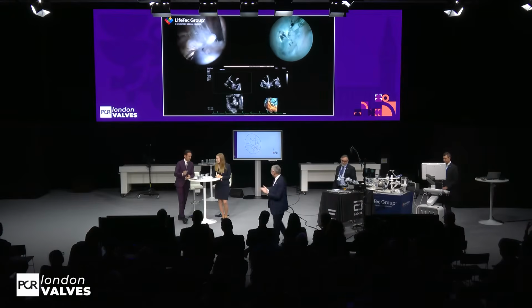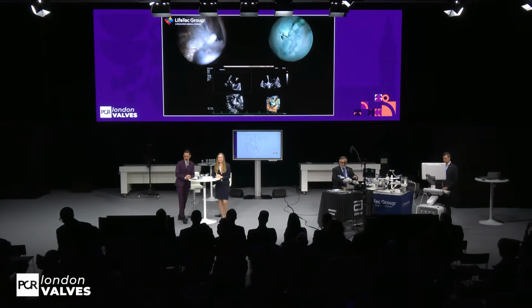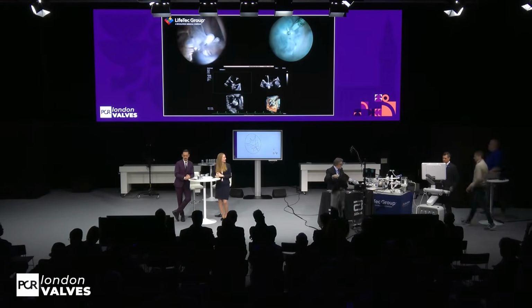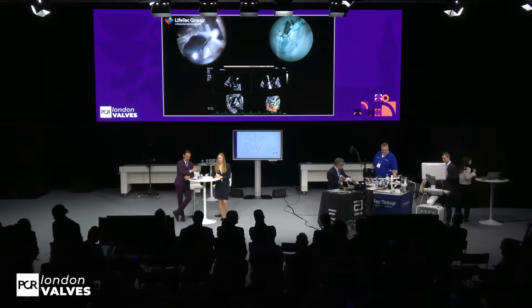Very nice and very clear demonstration. Yeah, absolutely. Thank you very much. So we're very interested to see how our operators in real life did their cases, and we will ask Yiling again to show us her case resolution with our slides.